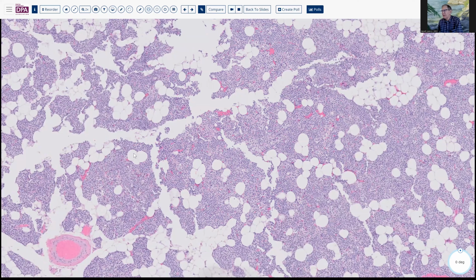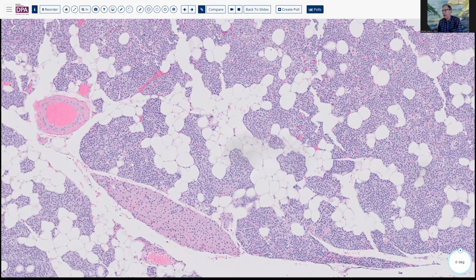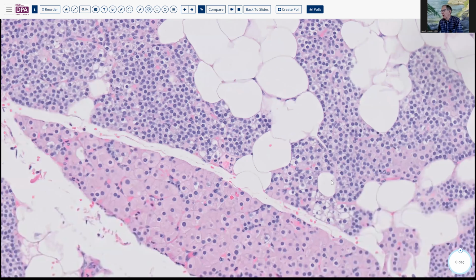Additionally, the other thing we can see here is that there are several different cell types that make up the normal parathyroid. We have the dominant cell type here, which you can see has nice rounded nuclei and pale bluish purple cytoplasm. There may also be areas where there are clear cells, as you can see here, a couple in this field over here as well.